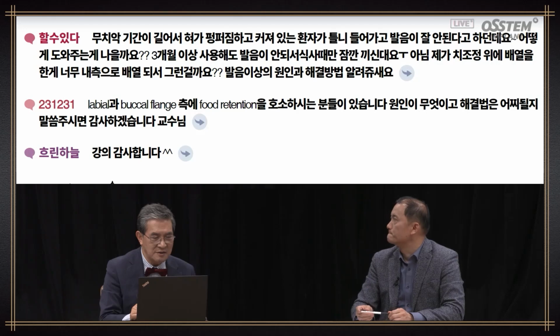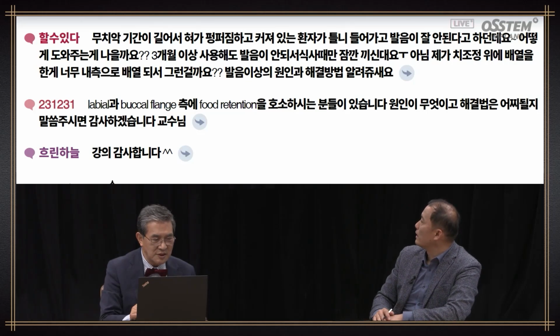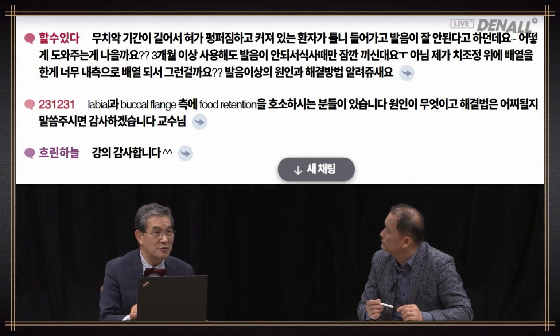And then the tongue has become big and flat because of a long edentulous period, so the patient cannot really wear the denture and cannot pronounce very well even after 3 months, so wears the denture only at mealtime. Or did I go too much internally in my alignment, or how should I solve these issues? Maybe there is a lecture on complications later on. But anyway, you can talk about this too.